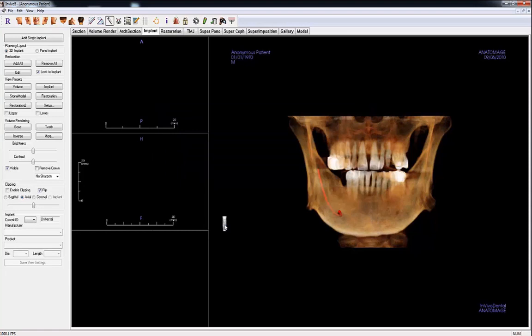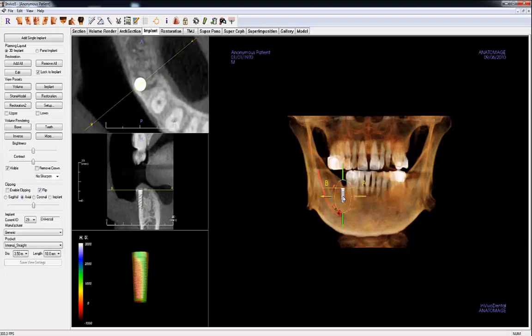The implant will be attached to your cursor. Left-click to place the implant in the general area of the implant site on the 3D volume. Once you have placed the implant on the volume, the other window sections will be populated with information. The top window is the axial cross-section of the implant. The middle window displays the cross-section that is the plane of the yellow AB line. The bottom window shows the density profile that displays the HU values immediately surrounding the implant.